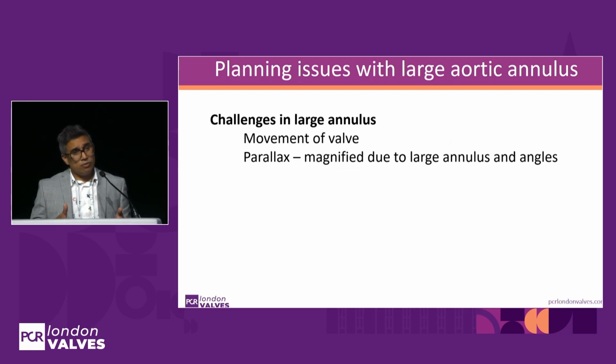The LVOTs can also be large, and so depending on the design of your valve, you might find that if you've got a very large LVOT, there's a tendency for certain valve platforms to dive into the ventricle. And probably the most important thing when coming into implanting these valves, the self-expanding valves in particular, is this issue of parallax.